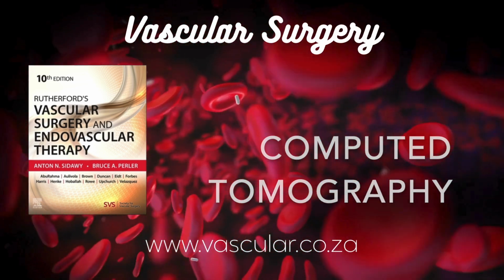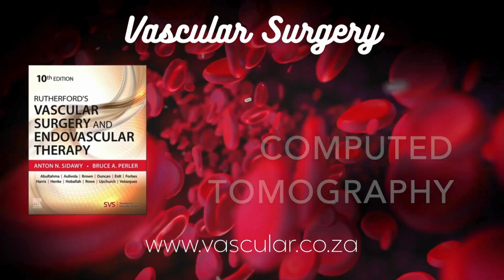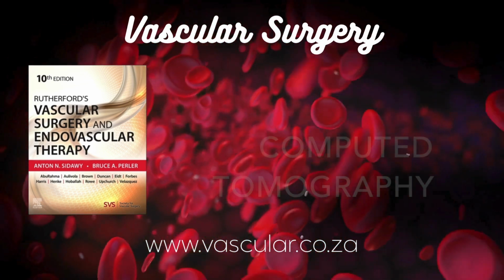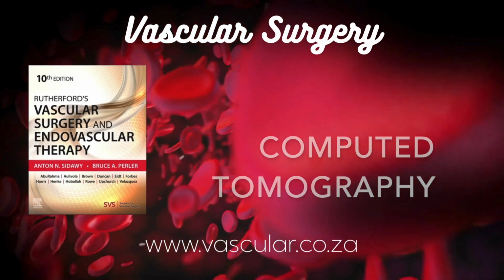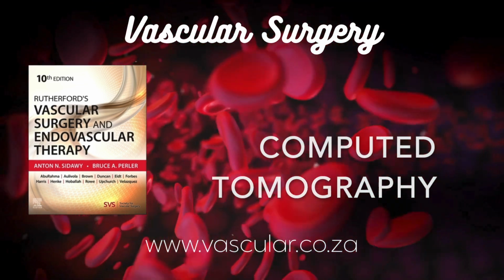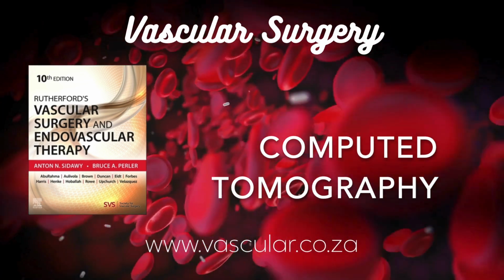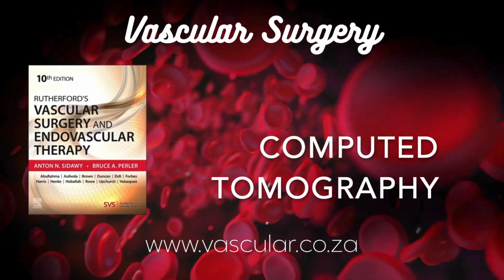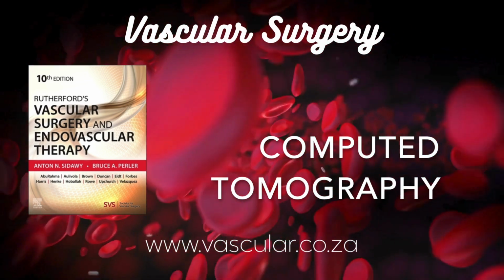Several things. The concentration of iodine in the contrast agent matters, how fast you inject, the injection rate, and the total volume you give the patient. Are they using less contrast now than they used to? Generally, yes. Faster scanners mean shorter scan time, so you don't need the contrast to hang around as long. Techniques have improved. We've gone from maybe 120, even 180 milliliters historically down to often less than 100 milliliters now for many studies. That's good. Less load on the kidneys.